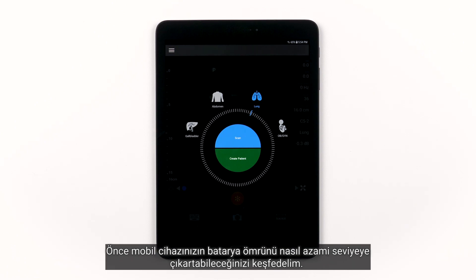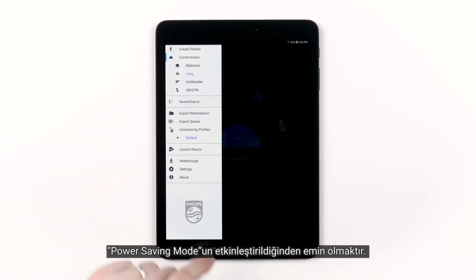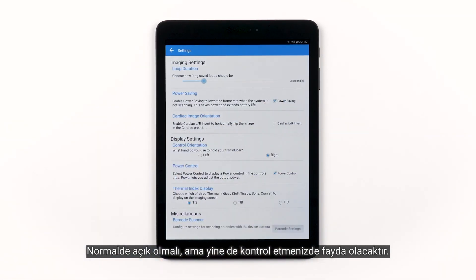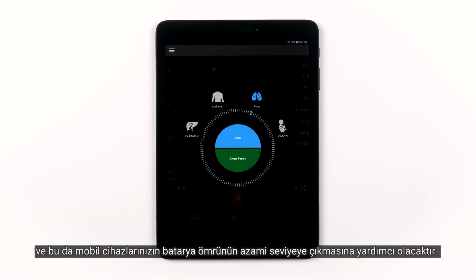First, let's explore how to maximize your mobile device's battery life. The first thing you can do is go into the Lumify Settings menu and ensure Power Saving Mode is activated. It should already be on, but it's worth taking a look. This will lower the frame rate when the system is not scanning, and will help maximize your mobile device's battery life.